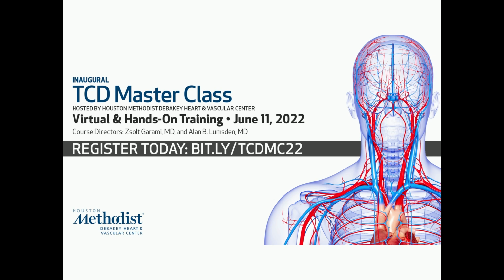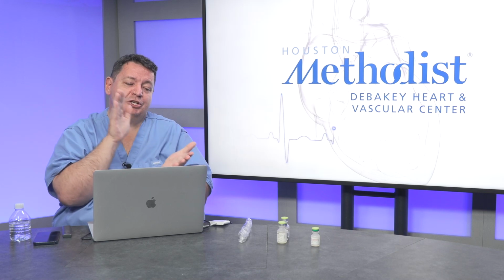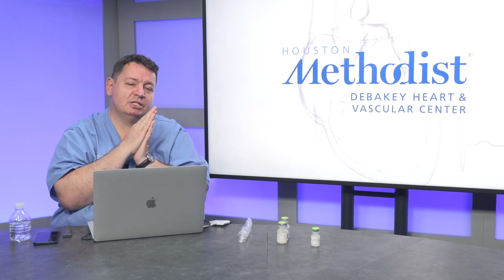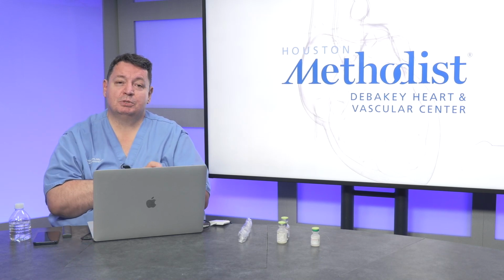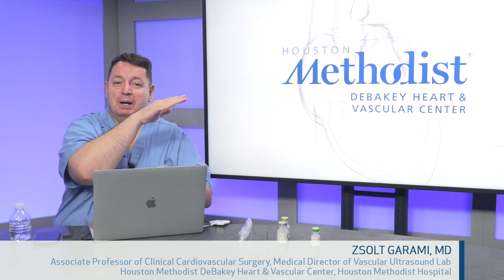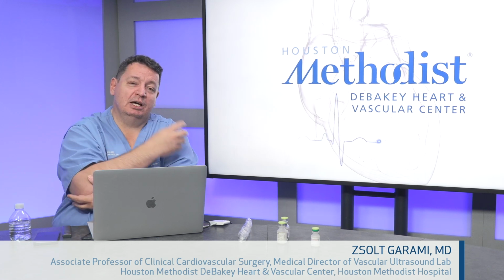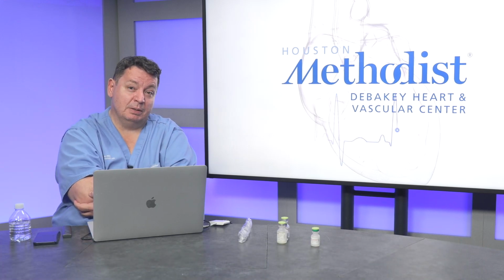I have one more. Can these bubbles impact oxygen levels? No, but the oxygen level can impact the bubbles. The example for that, if you have a patient with a prosthetic heart valve, the metals generate cavitations, and that cavitation is producing more than 3 bubbles per minute, may produce TIAs, may produce some symptoms. So what we'd like to do is administer oxygen and count if your bubble number is going down. Because if you put 100% oxygen, just 5 liters for 10 minutes, you will see a tremendous decrease of these bubbles.